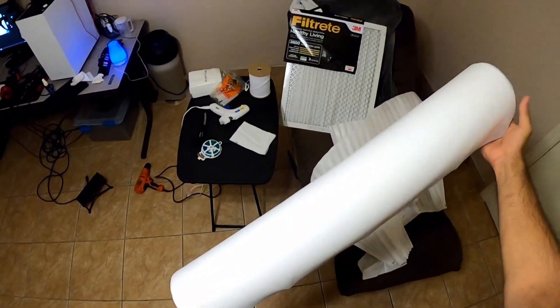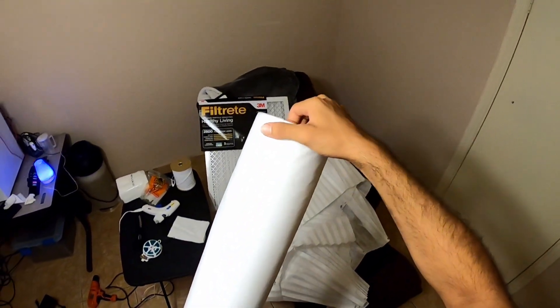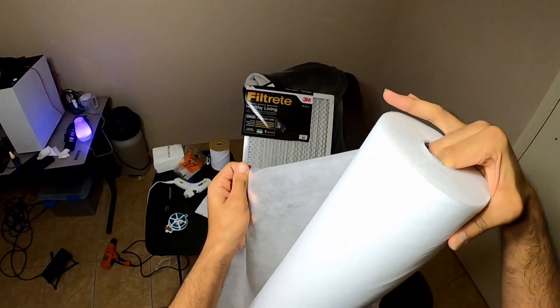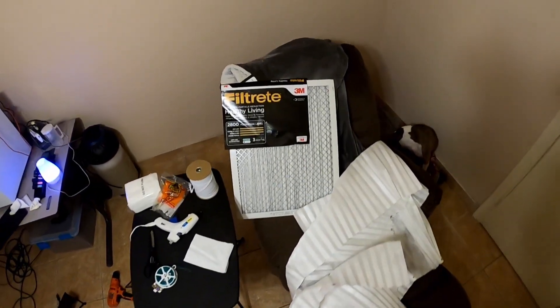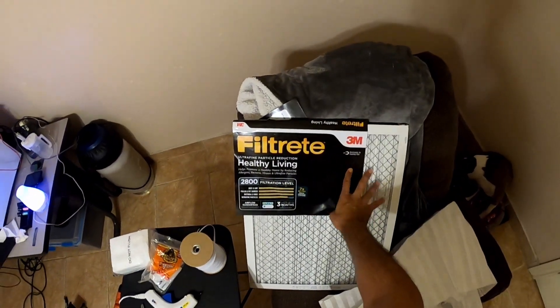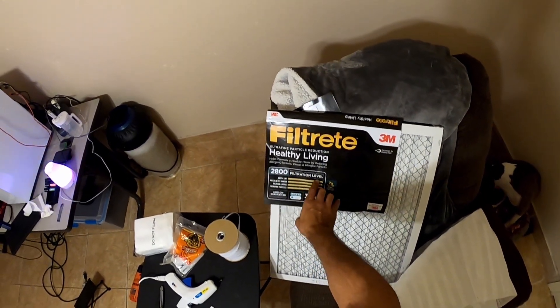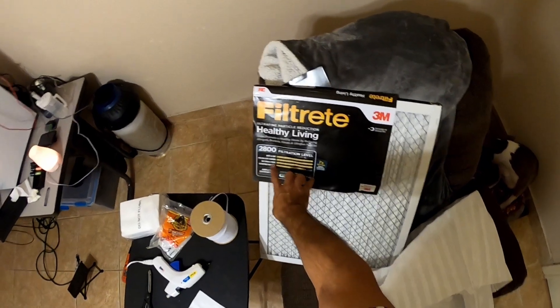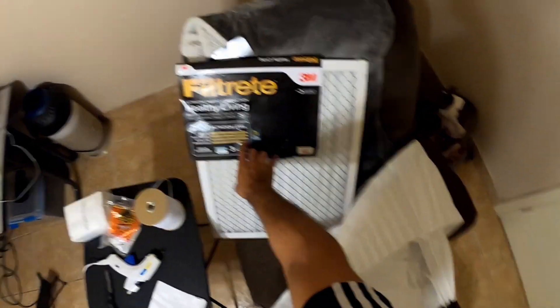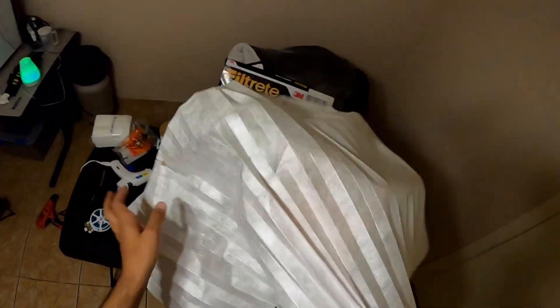First of all, I got this 30 GSM non-woven fabric — I think this roll is used for spas, but this material should assist. And then I got some 3M air filters with a 2800 filtration level. I believe 1500 should be sufficient, as it shows it can stop the passage of bacteria and viruses. This is what it looks like when you open it up — plenty of material.